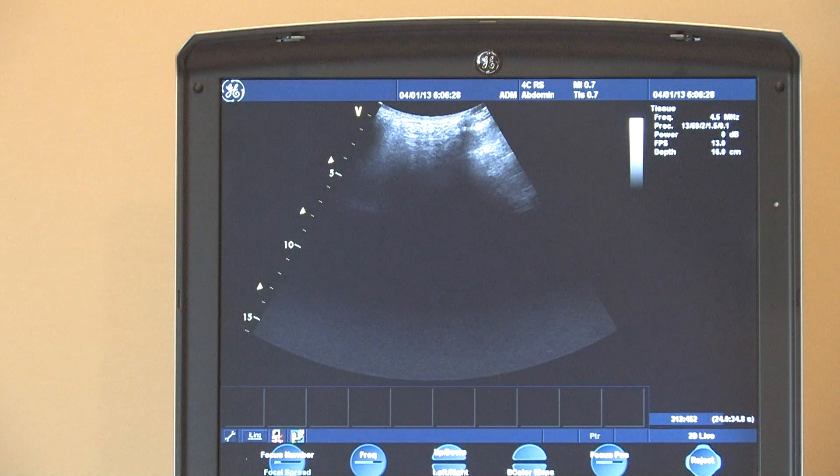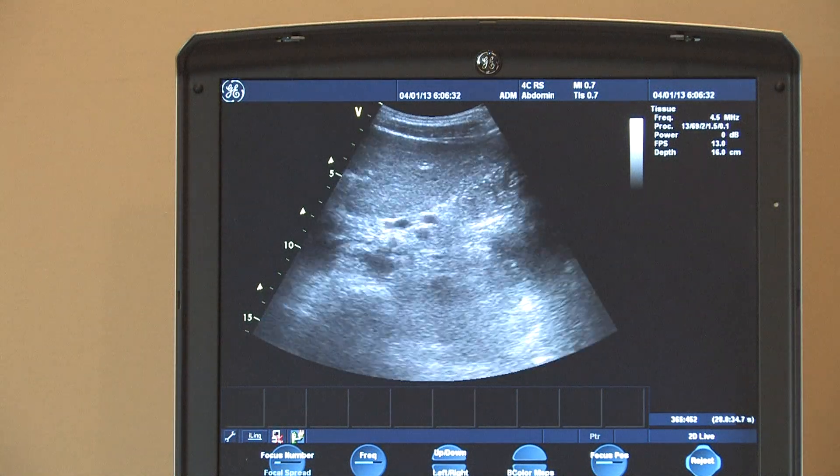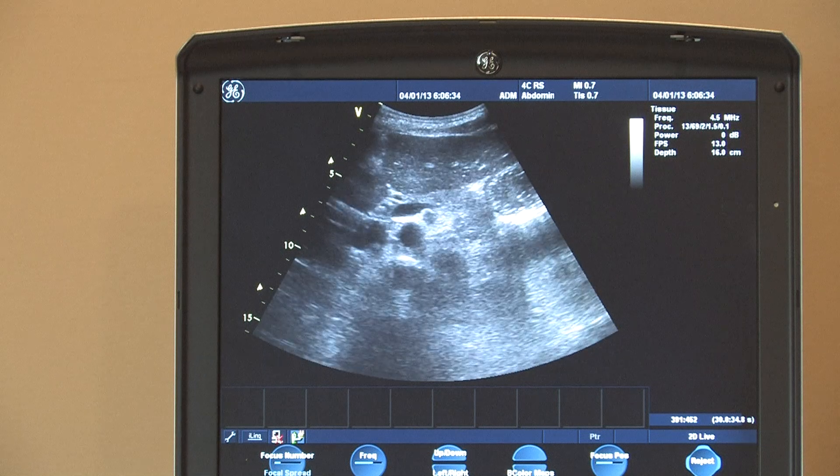This is the 4C abdominal probe. It images just fine and all of its functions work.